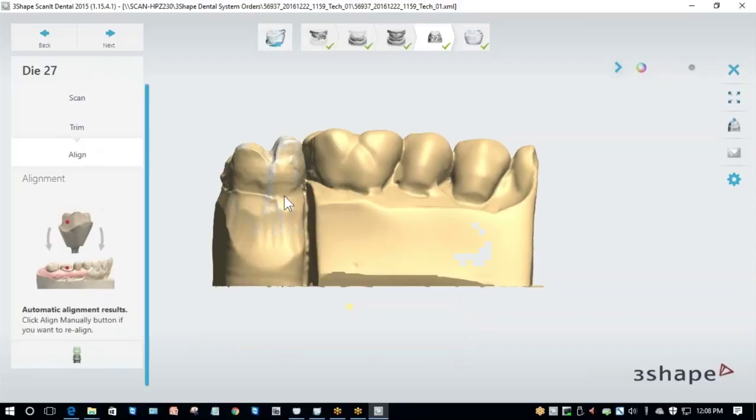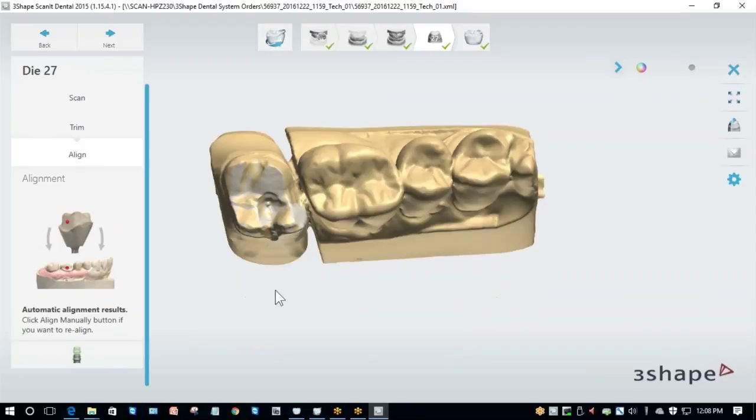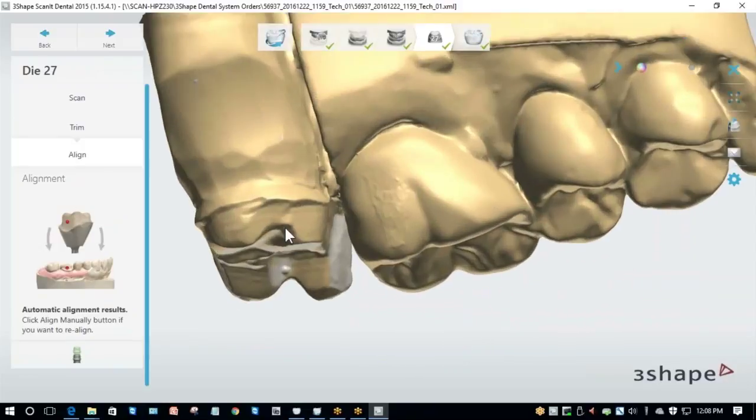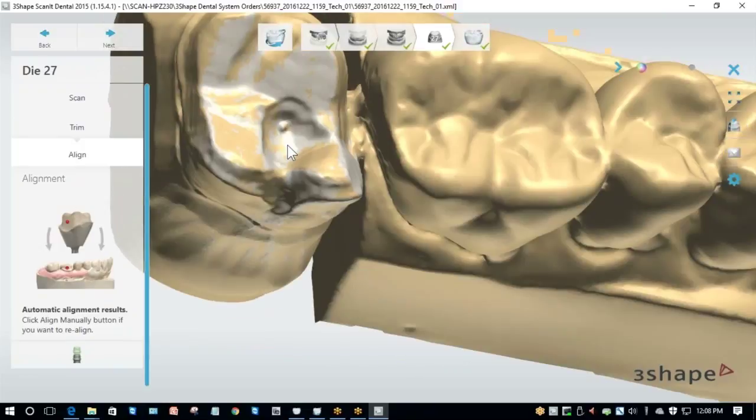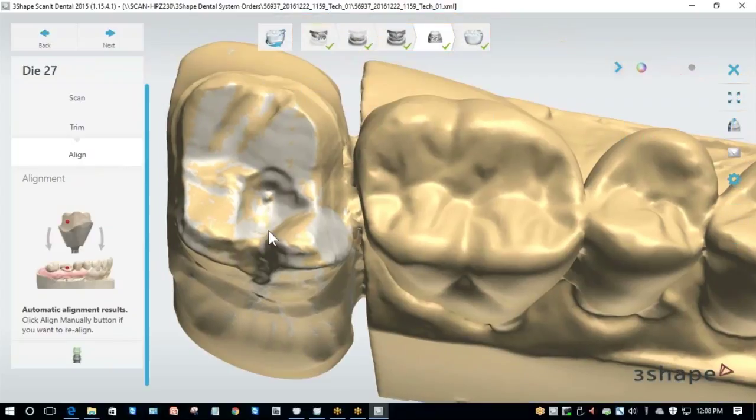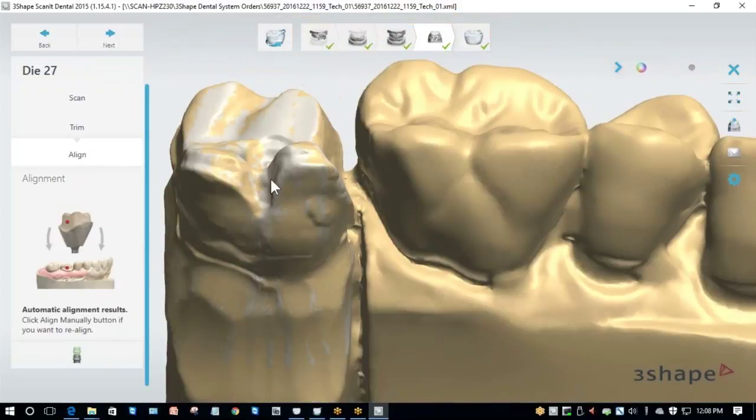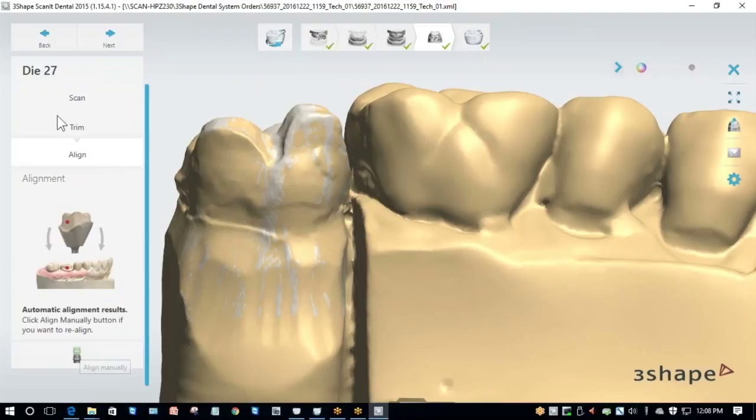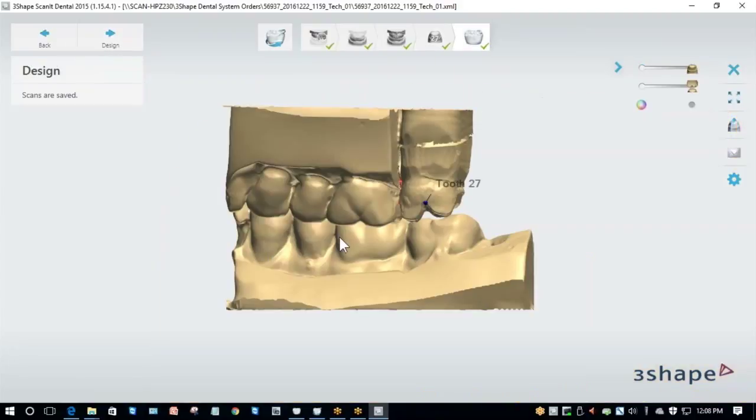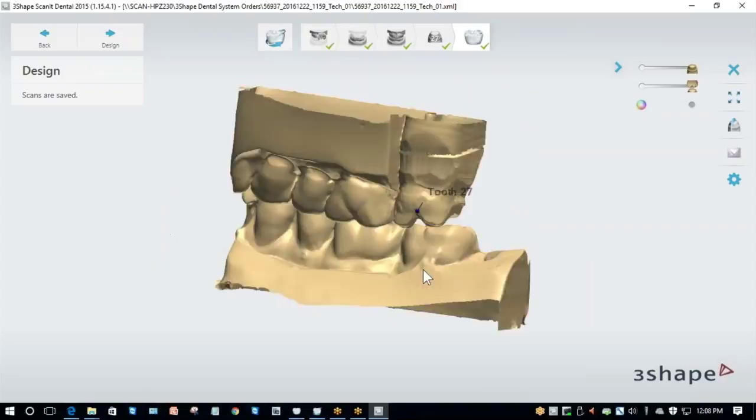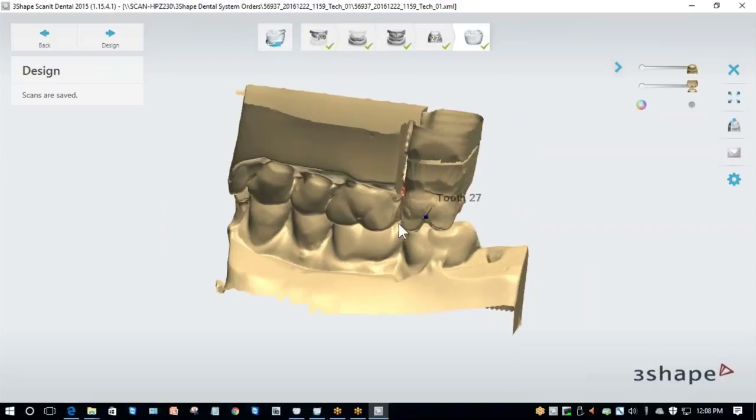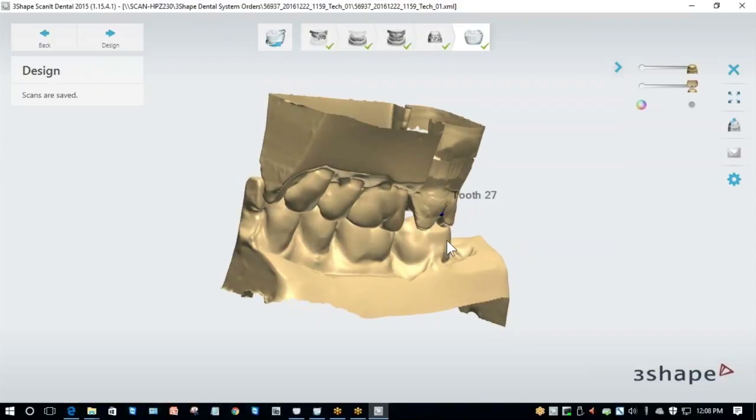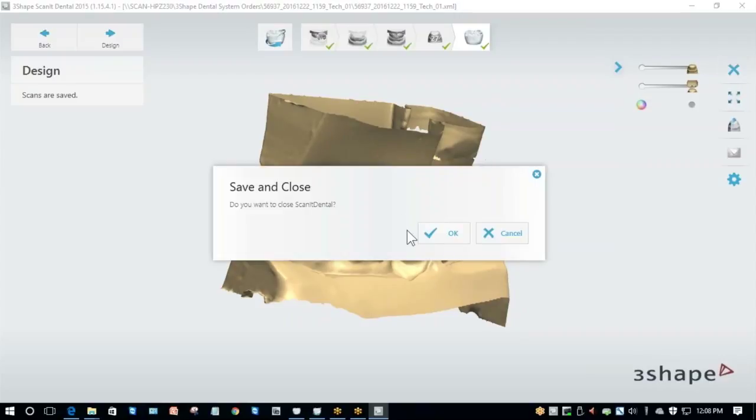I'm going to come over here and click on Align. And I can see there's my camouflage pattern, so I know that my die is accurately aligned. If I needed to align my die manually, all I would need to do is click on this button right here to manually align my die. I'm going to click Next. I'm going to make sure all my scans are visible and I'm going to make sure I have check marks on each box up here. As long as I have all of that, I can exit my scan and I'm done with that process.